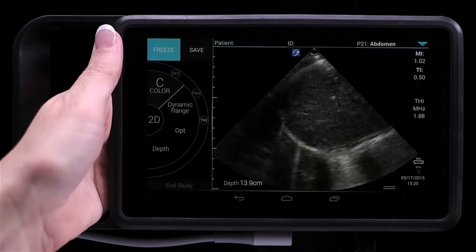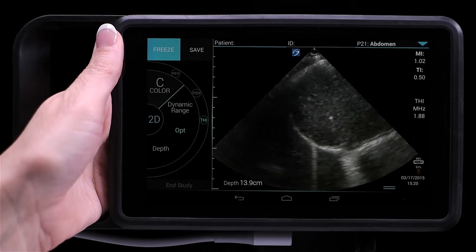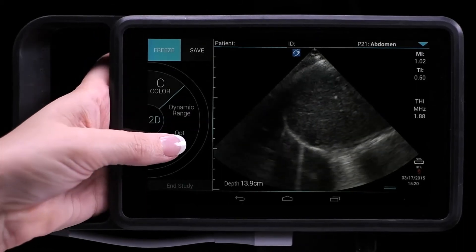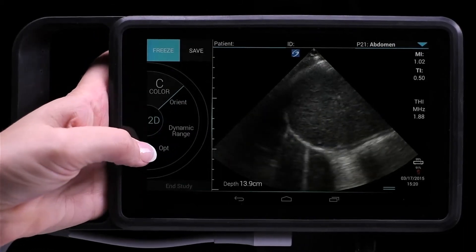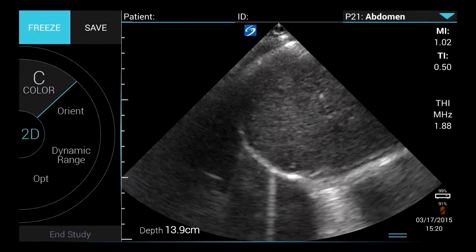You can adjust other 2D options, such as dynamic range and orientation, by sliding the wheel with your thumb.